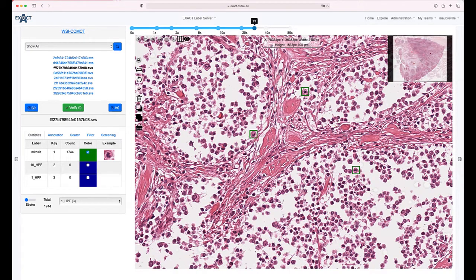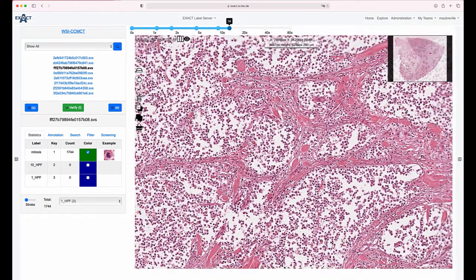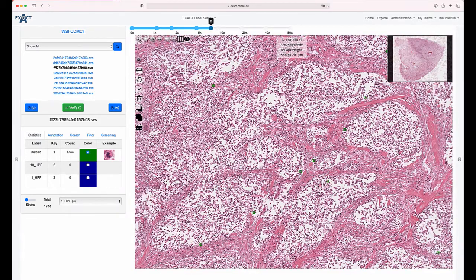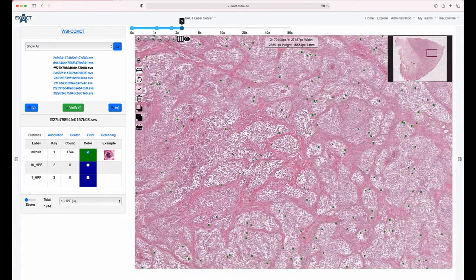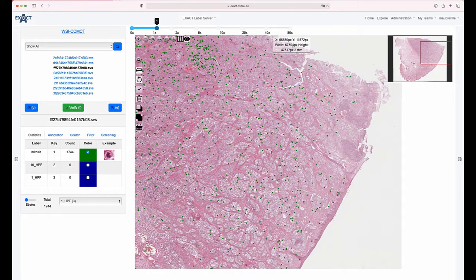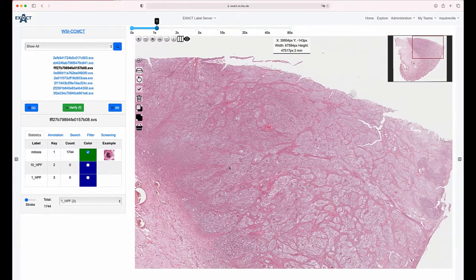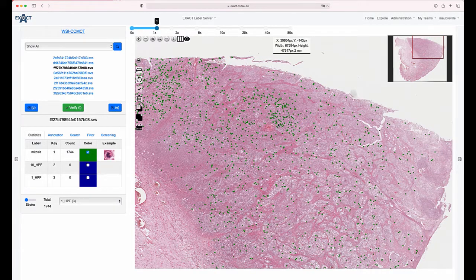What you've learned is what mitosis is and that it needs to be counted — but I didn't tell you where it needs to be counted. Many grading schemes require pathologists to count wherever there are the most mitotic figures. That's hard to estimate. In this image there are three mitotic figures. If we zoom out, it becomes impossible to distinguish mitotic figures from other cells. And without annotations, it's impossible to tell which region had the most mitotic figures.